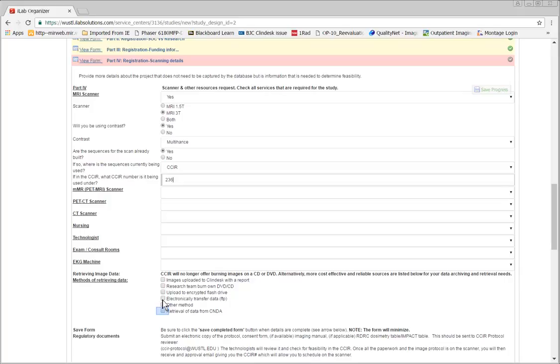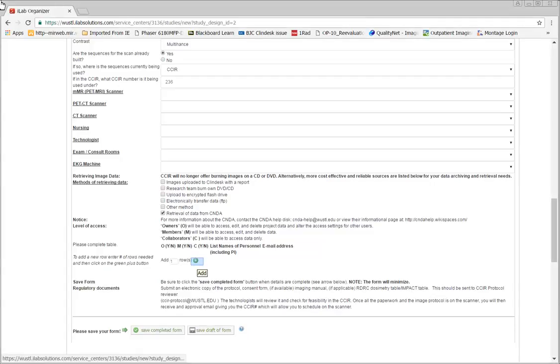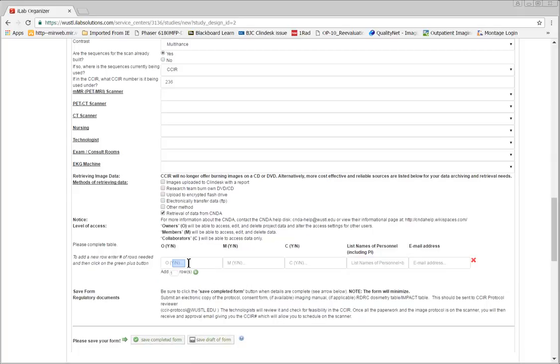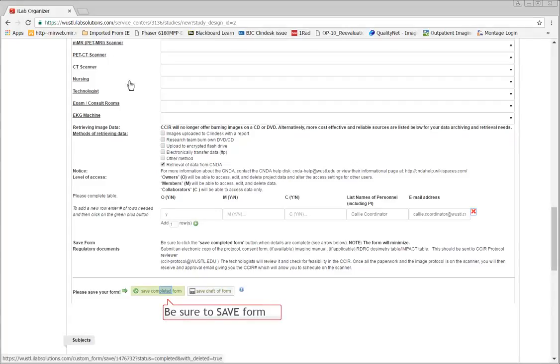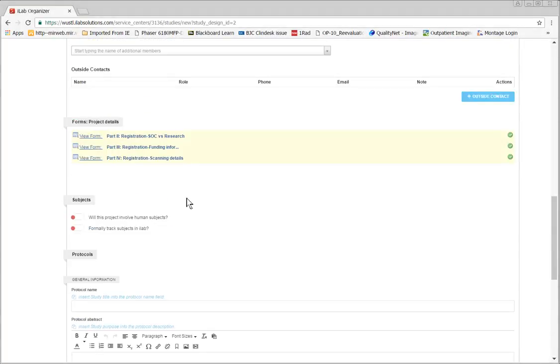CNDA is the most common data retrieval method for research studies. Here's where you add the individuals who will have access to the CNDA data repository. Be sure to click the green save button. Clicking these toggles will allow iLab to historically track all subject names and information for this project.